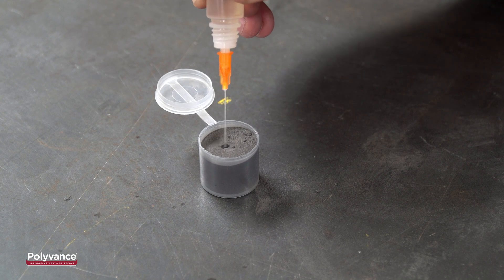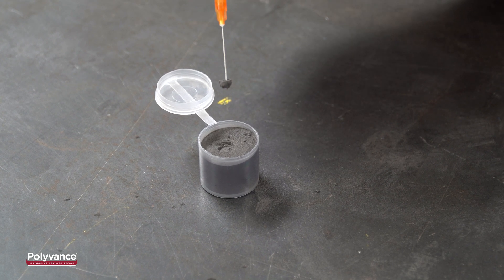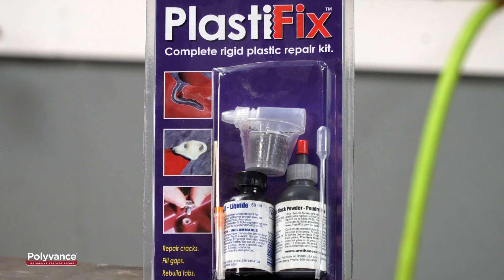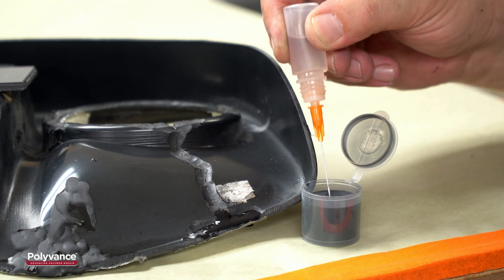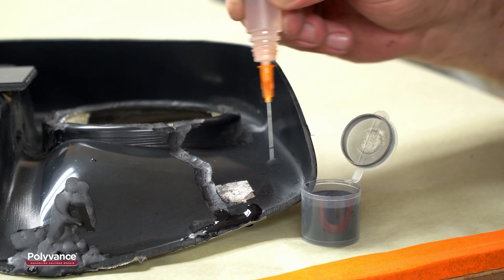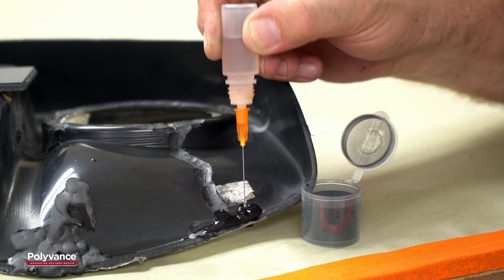ABS can be repaired by a variety of methods, but one of the easiest and most effective is Polyvance's PlastiFix Rigid Plastic Repair Kit. This liquid and powder combination creates a rigid plastic that softens the base material for an extremely strong bond.